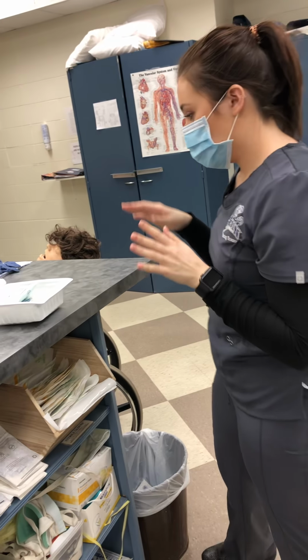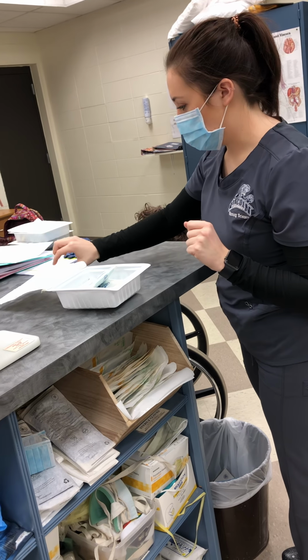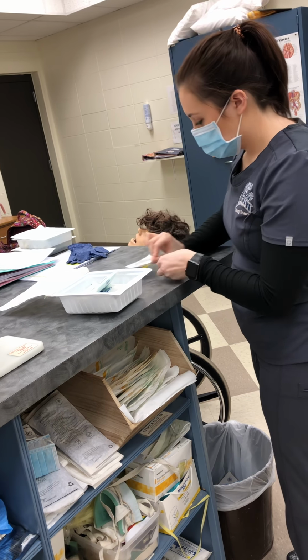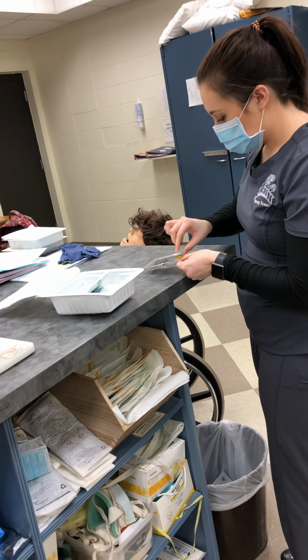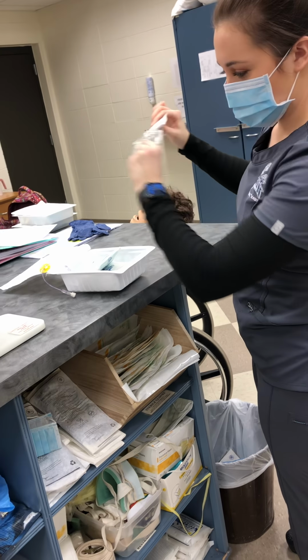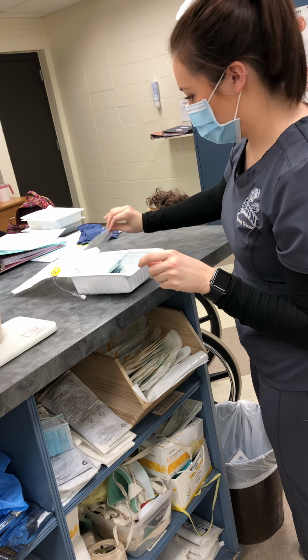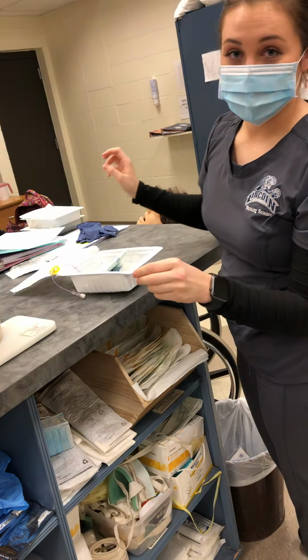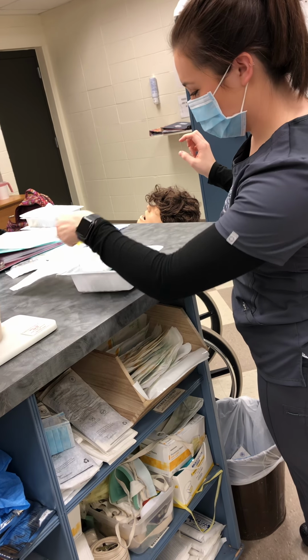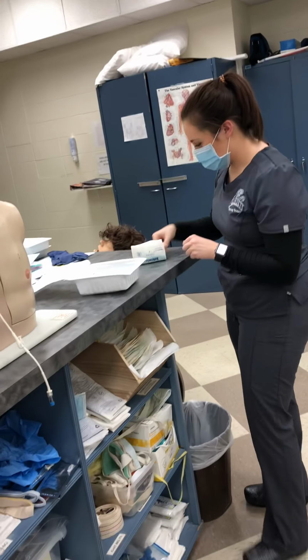Since the rest of this is sterile, the next thing I'm going to drop in is my needle. Then I will open this away from me and drop that into my kit. Normally it would not fall out, but since this is a demonstration, we're just going to say this is sterile because I don't have any more needles. Okay, so I'm going to pull out my sterile gloves.